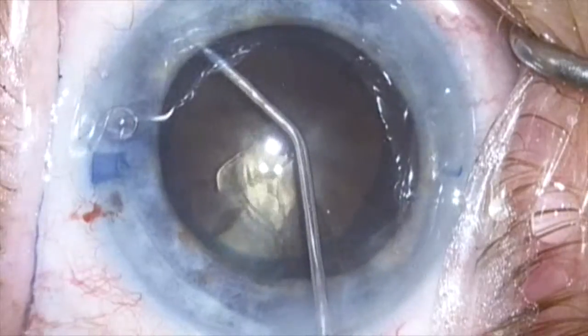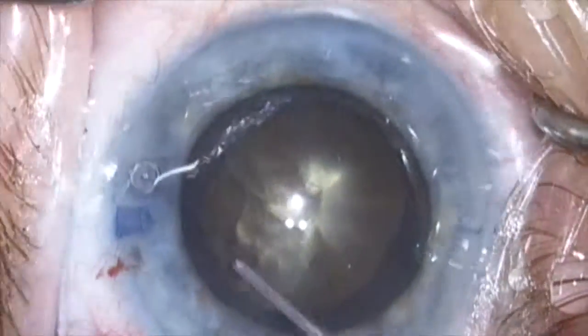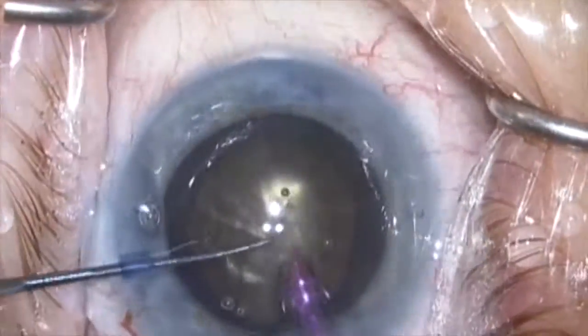Hydrodissection of the nucleus is carried out, but it's done very minimally as it's really not necessary, and I don't want to blow out the capsule.